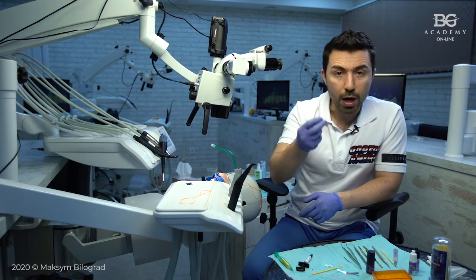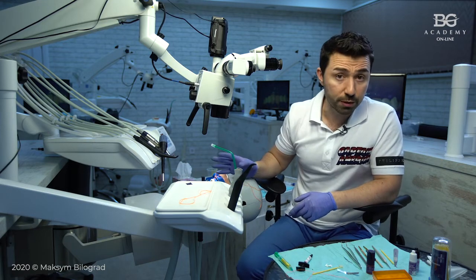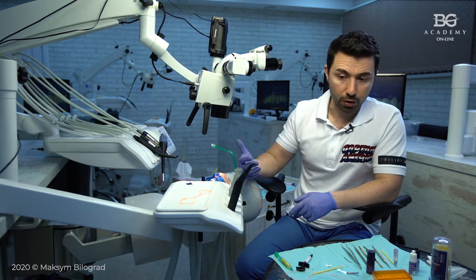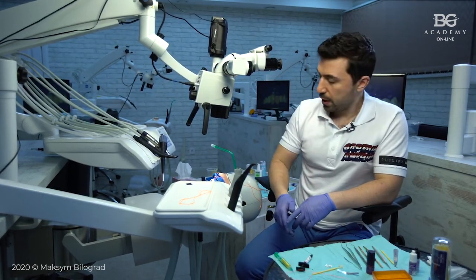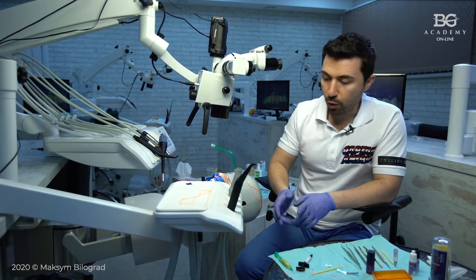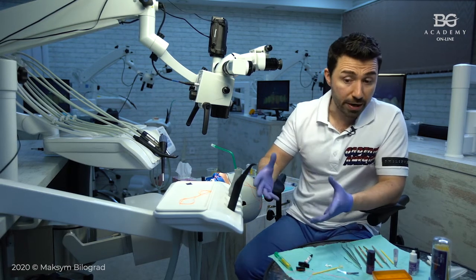The main reason why there is postoperative sensitivity after you bond your veneers is that you are not respecting the bonding protocol. For example, you over-etch dentin, or there is water, or whatever, or you didn't apply enough primer, or you didn't apply enough bonding agent. You dry too much, for example. You are not using rubber dam or whatever.